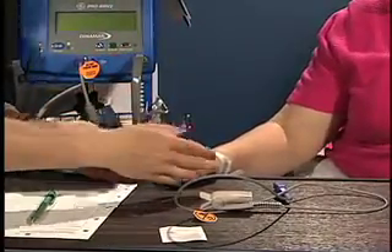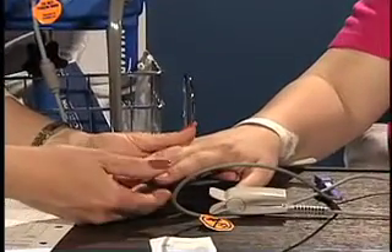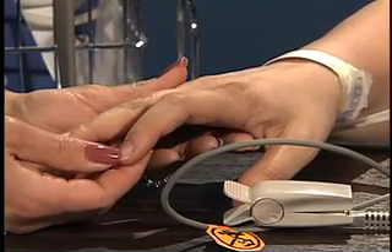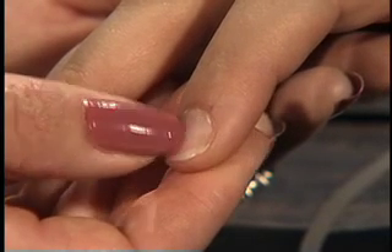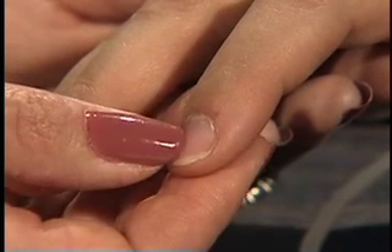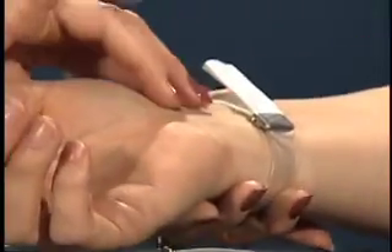Select an appropriate site for the sensor probe. Preferred sites include the client's index, middle, or ring finger, but other digits can be used. Assess the capillary refill in the digit. If circulation is compromised, indicated by a prolonged capillary refill time, an earlobe or the bridge of the nose may be used. Check the pulse at the site closest to the digit that will be used for monitoring.